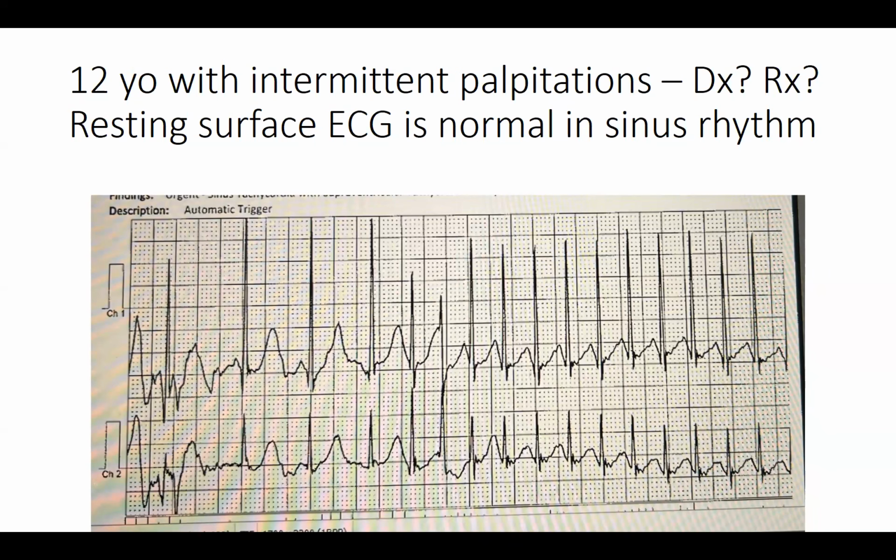Okay. And again, if we were going to do an ablation in this patient, I would basically go into the procedure thinking to myself, keep an open mind. I agree with you 100% that this probably is an RP interval that exceeds 70 milliseconds, but I've been wrong many times, unfortunately, so I just never really know for sure. I would say again that we're not pre-excited.